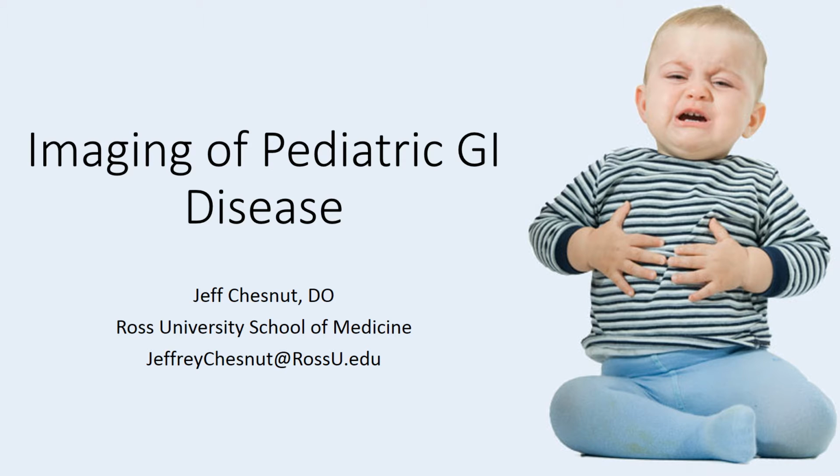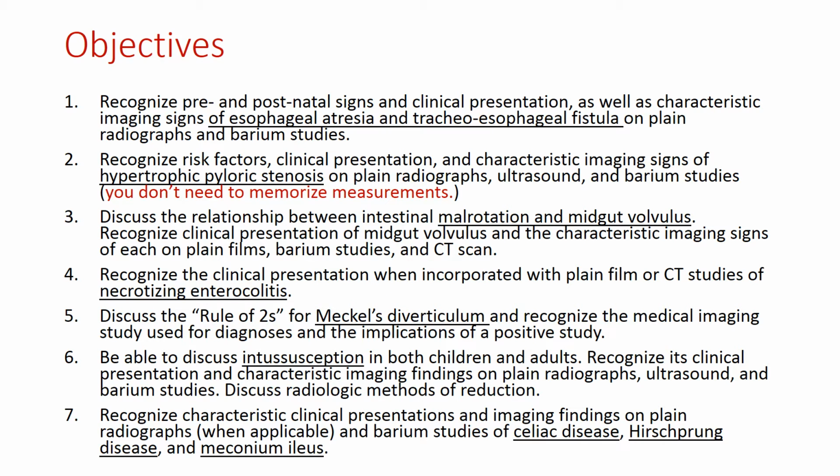Let's talk about imaging of pediatric gastrointestinal disease. So the objectives, there's a lot of words on here, but basically they're pretty much the same objectives for the most part, just different disease processes. And the disease processes are underlined for you.